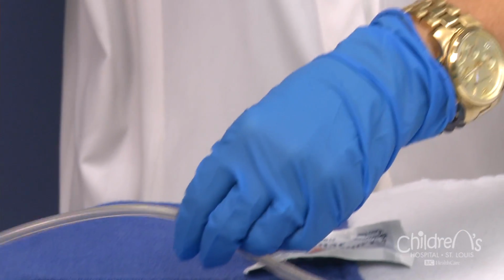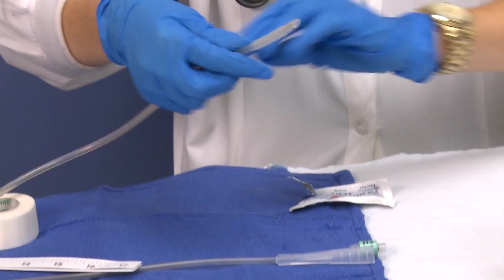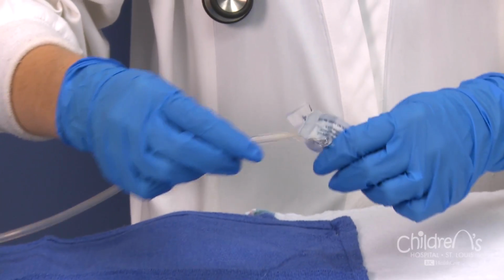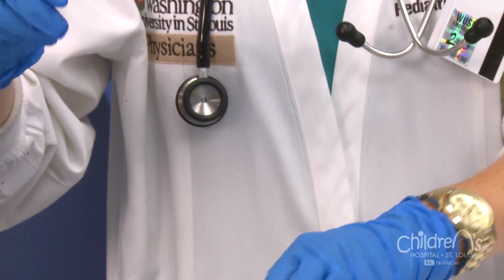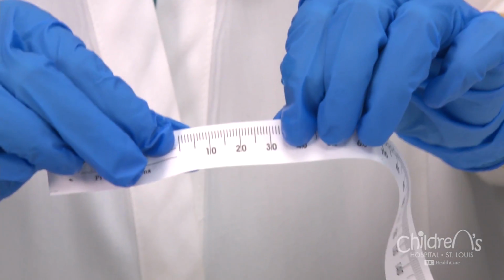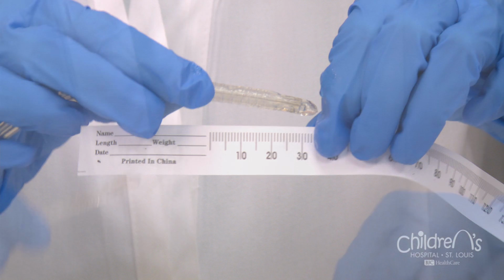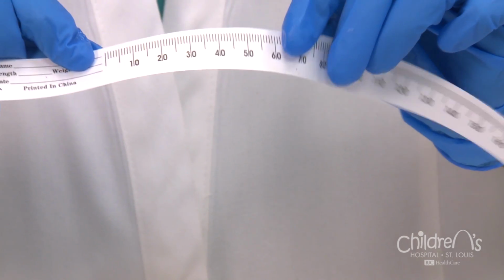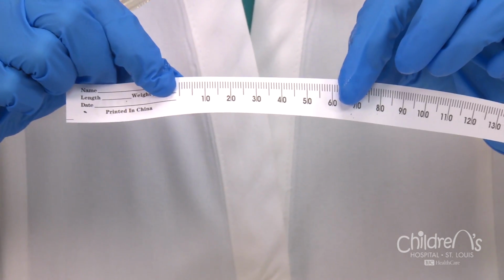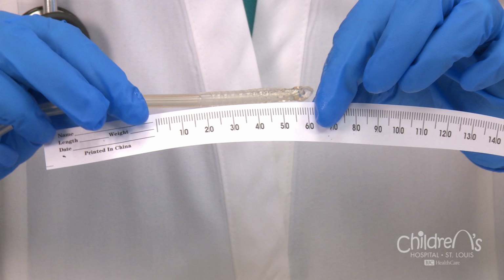Get the Foley that is the same size as your child's G-tube. Put a small amount of water-soluble lubricant on the tip of the Foley. If your child's weight is less than 15 pounds, gently insert the tip of the Foley about 1 1/4 inches or 3 centimeters. For children who weigh more than 15 pounds, insert the Foley in about 2.5 inches or 6 centimeters into the gastrostomy tract.